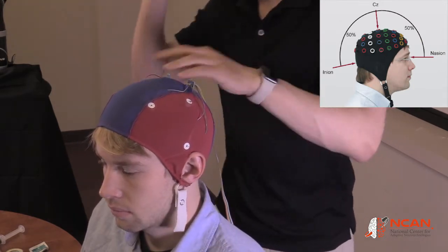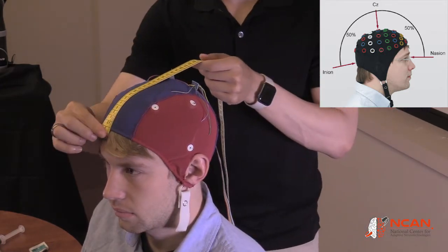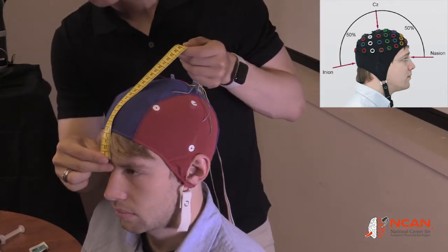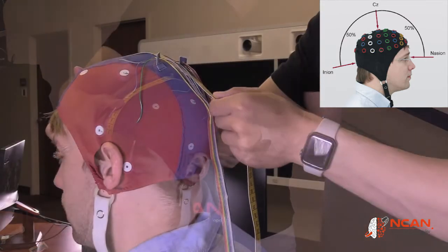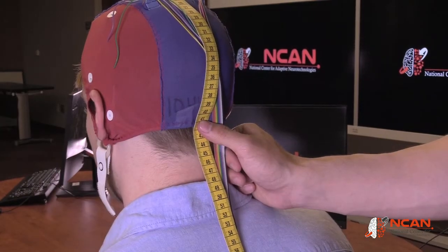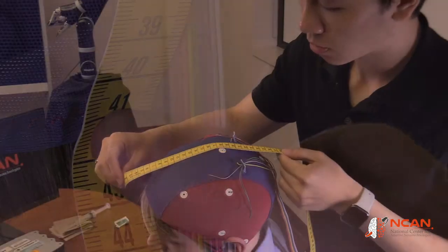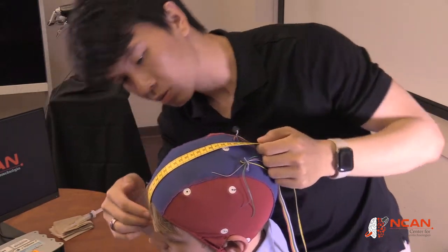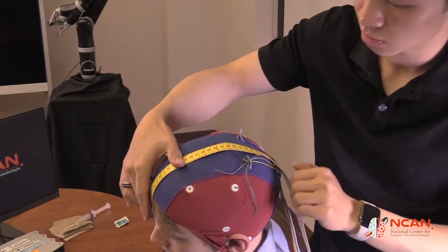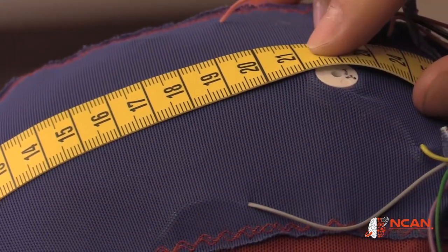nasion and the inion. With a measuring tape, we first identify the location of the nasion, place the measuring tape, and find the reading at the inion, which is about 41 centimeters. We then locate CZ and ensure that it is at about 20.5 centimeters from the nasion.